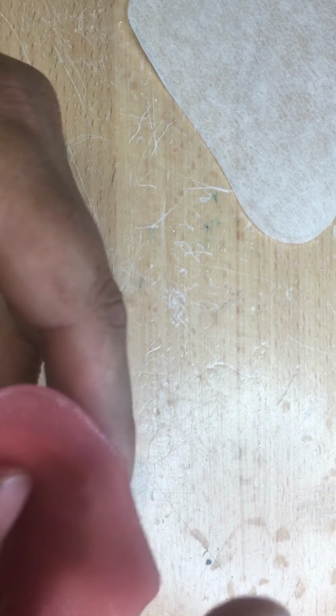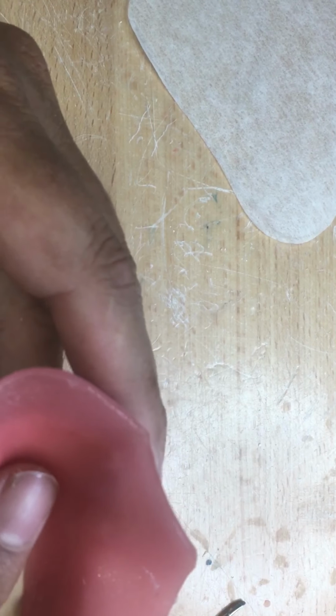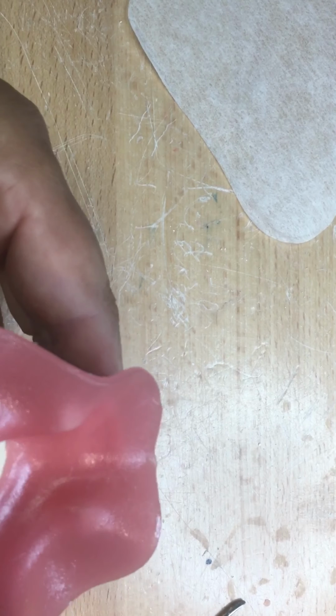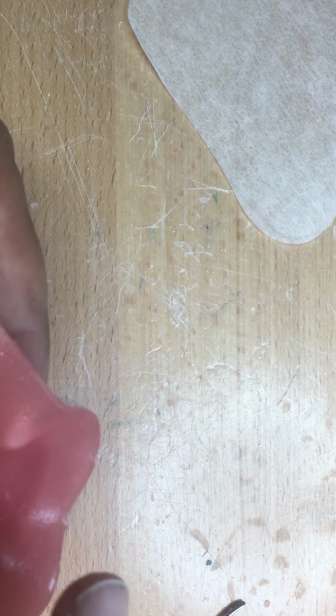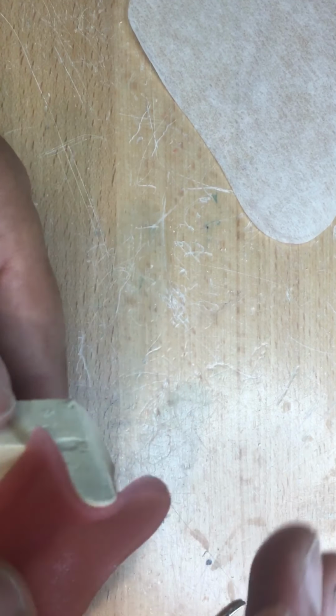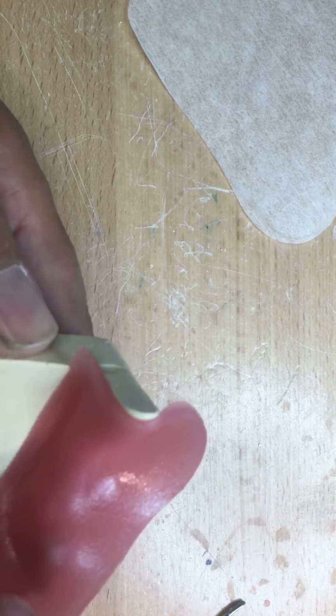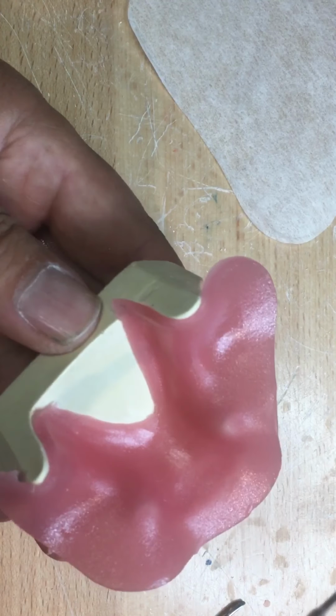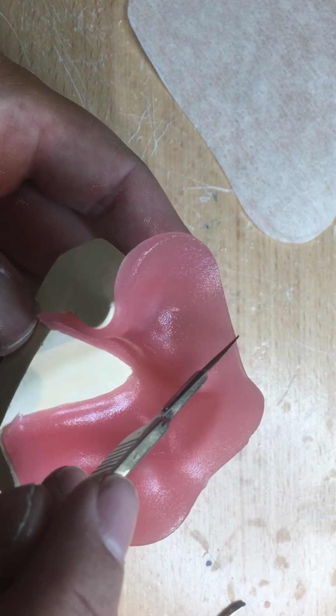Now you can see here, if I put too much pressure, I'm going to thin out the base plate. We don't want this base plate to break, especially in the patient's mouth. That would be setting off a lot of alarm bells for the client during a bite registration that something should fracture.